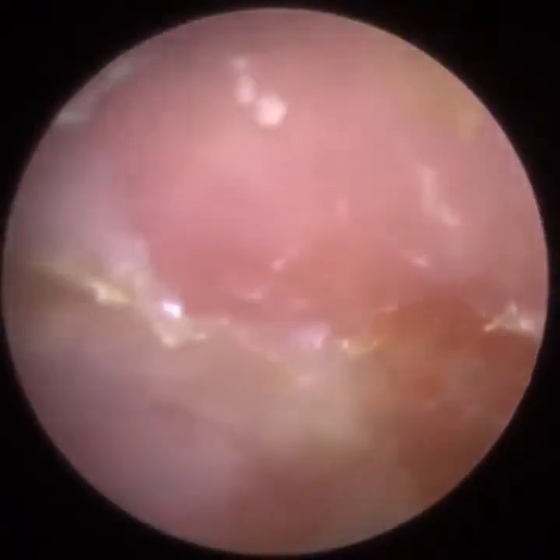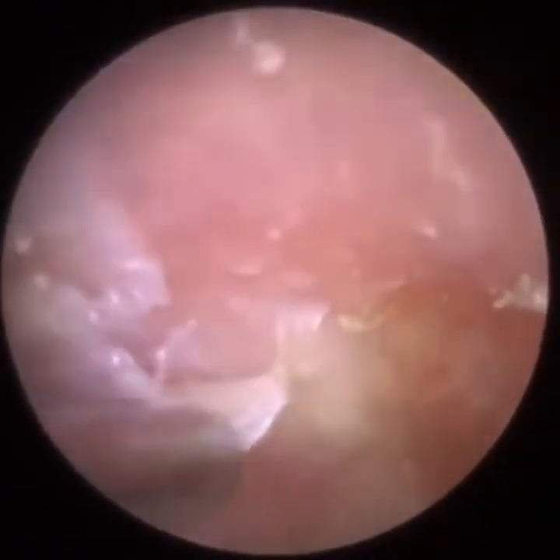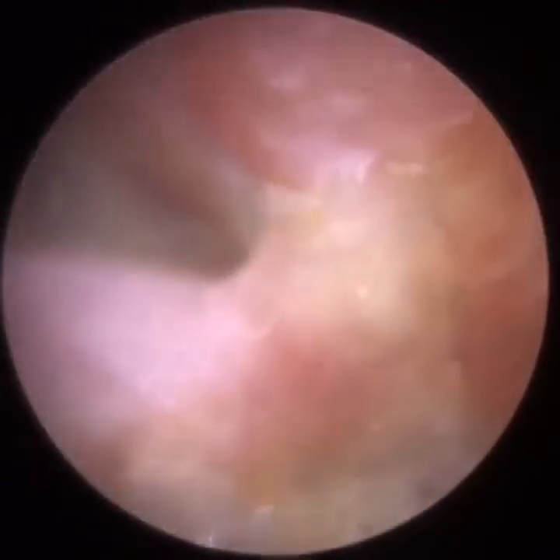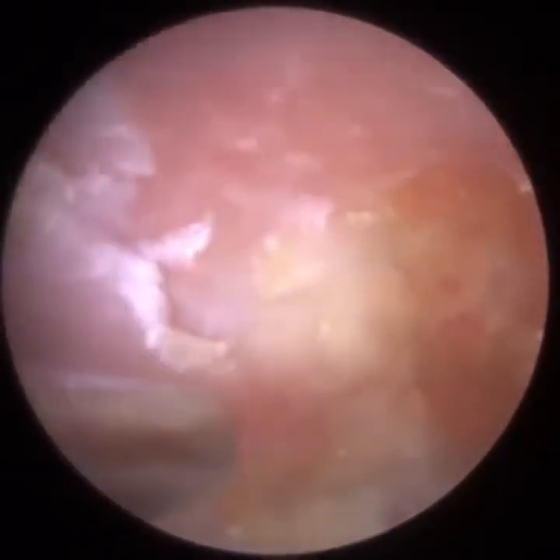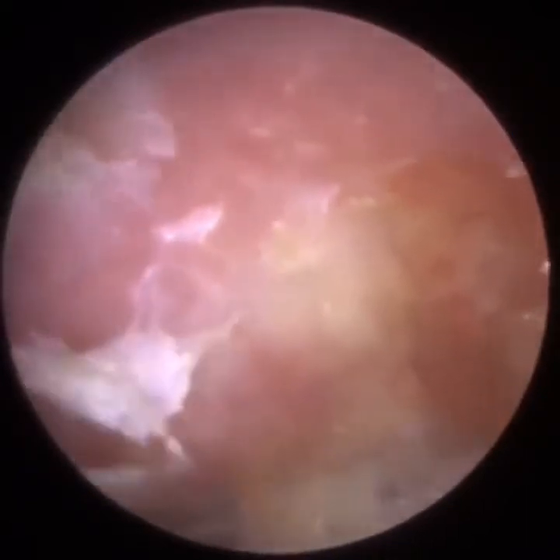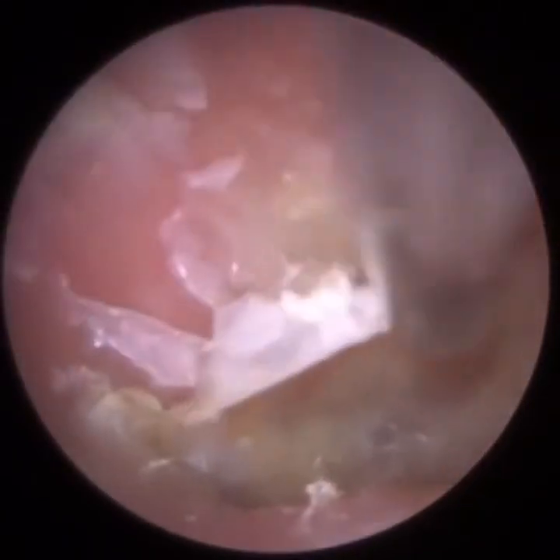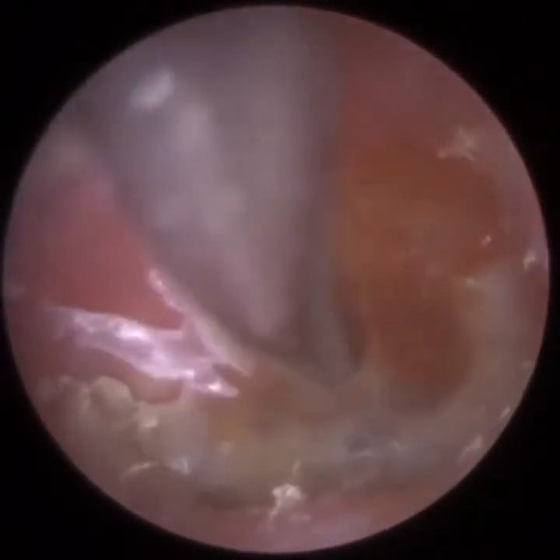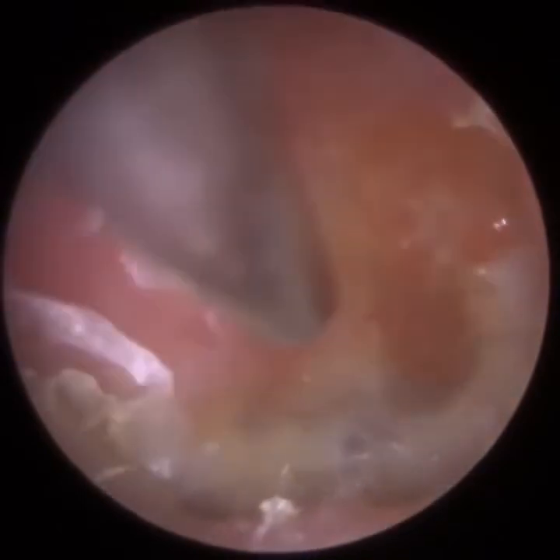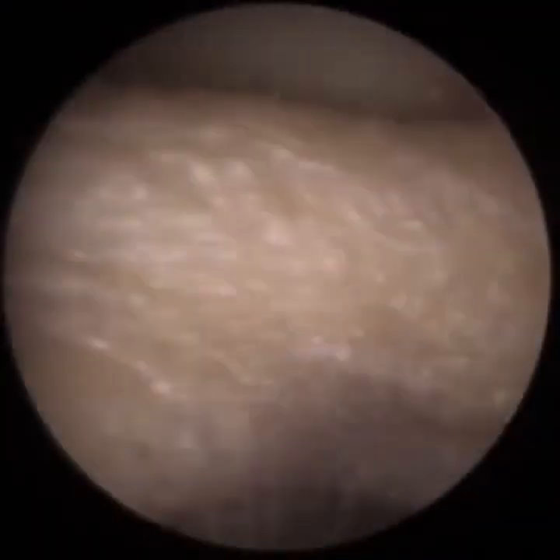Imagine peeling a stamp off an envelope. It's similar to that, but obviously we're on an eardrum, so someone's eardrum is at risk if we make a false move, so we're going to be really gentle. As I get a suction grip, I want to pull the sucker away from the eardrum to peel this. Just on the hammer bone there, so we reveal some of the hammer bone. Just wipe the lens, sorry, I didn't edit that out.